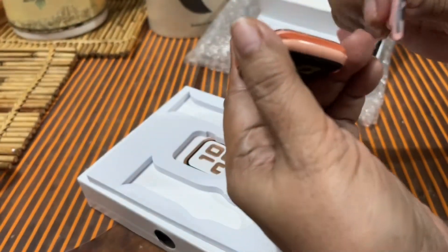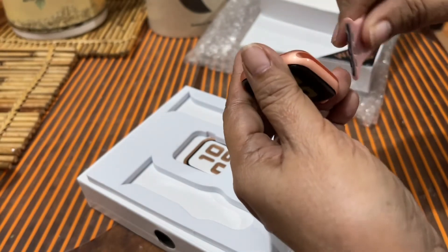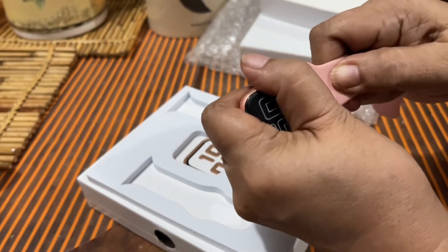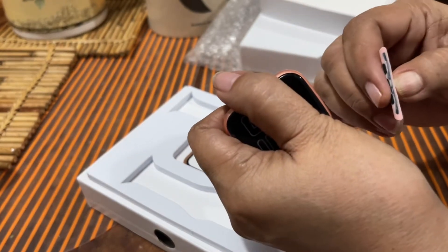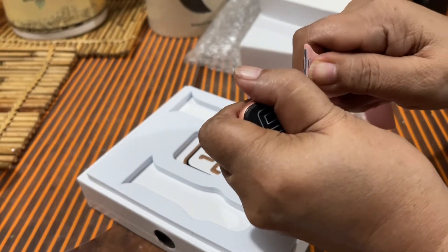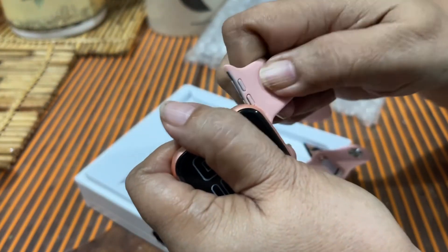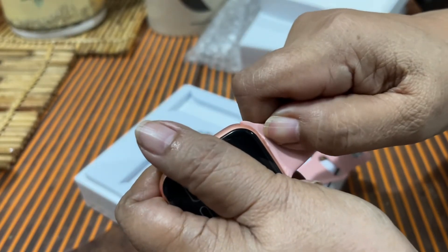Nung isinuksok ko siya, tinignan ko kung saan yung may butas-butas, saan yung wala — so ikinabit ko na. Kala ko, ang galing ko eh. Yung pala, merong matulis yung pinakasnap — yung pinakasnap niya sa ilalim. Pag ikinabit mo ng mali, masakit sa kamay. Although I learned it the hard way, ikinakabit ko na siya.